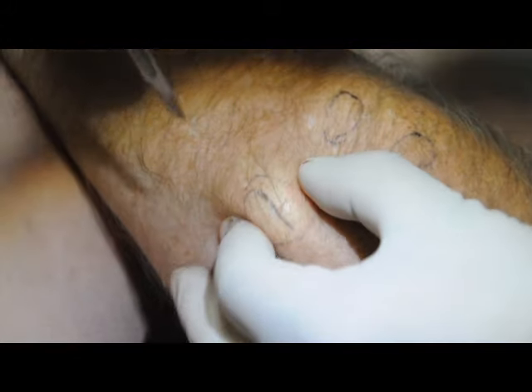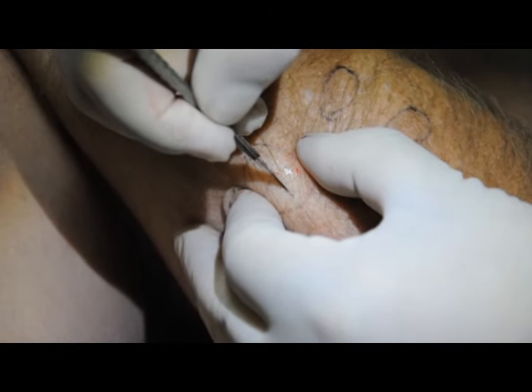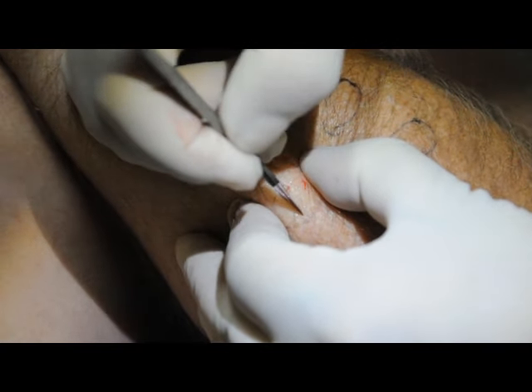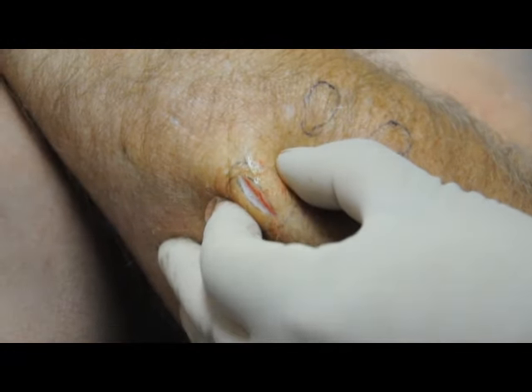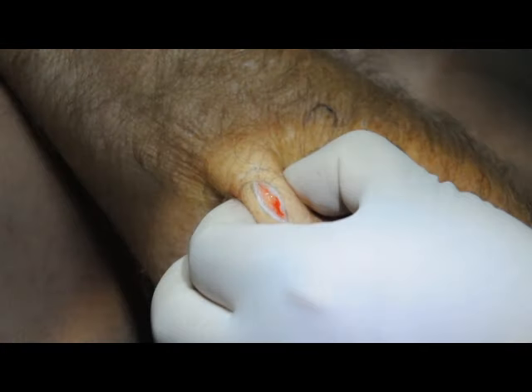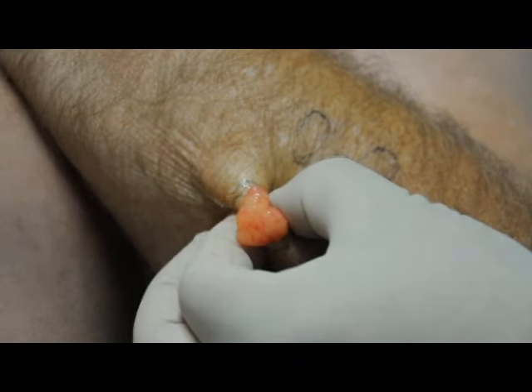This is a subcutaneous lipoma that's not attached, so it should be straightforward. Take a little cutting on this skin — and there you go. Do it with the lipoma, that's the challenge. And we're just going to pop it out.